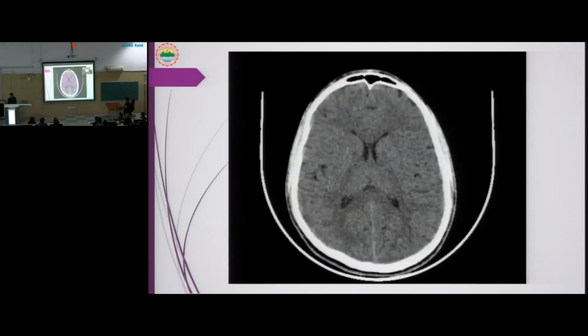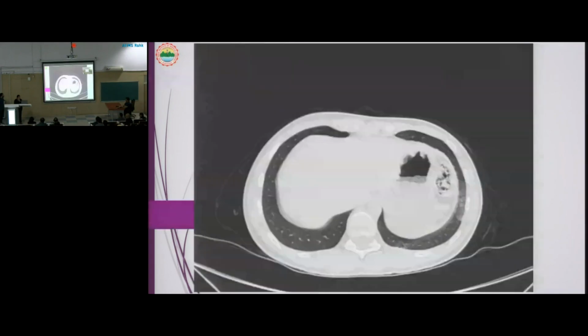Good morning, respected all. I'm Dr. Neha from the Department of Radiodiagnosis. We subjected the patient to a PAN CT scan, where we did chest, pelvis, abdomen, head, and cervical spine. The head was absolutely normal in this patient. Coming to the images of the lung, we can see patchy areas of ground glass opacity in the posterior basal and lateral basal segments of the left lung.